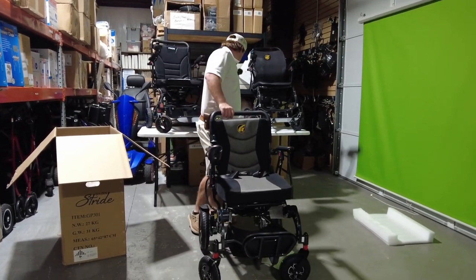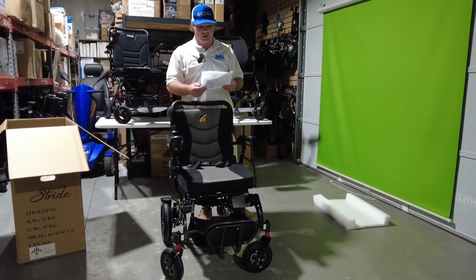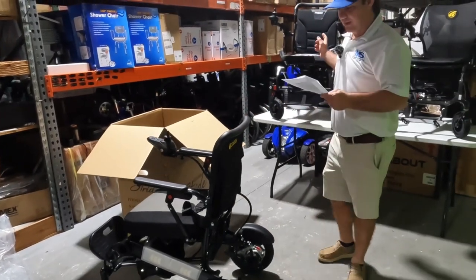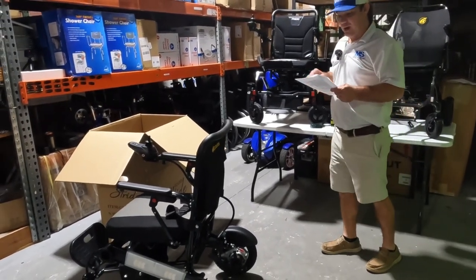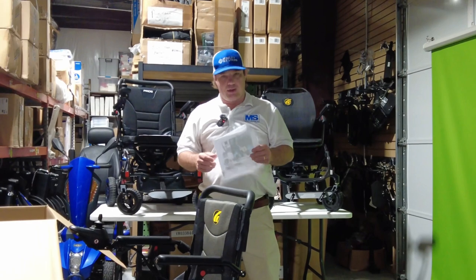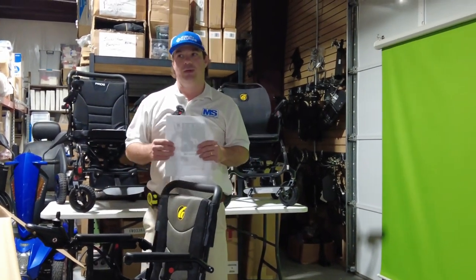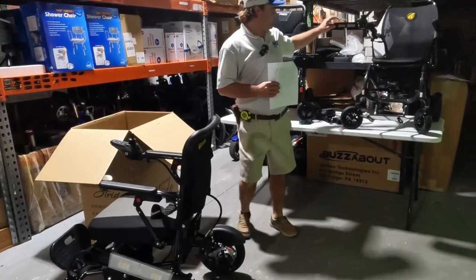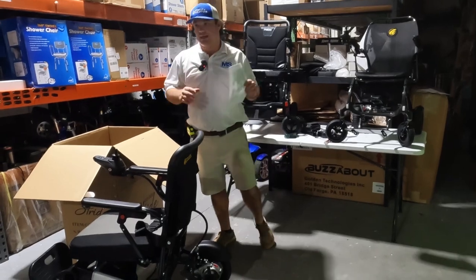So this is the Stride, model GP301 — we'll have some specs and a link to the spec page. It has a 265-pound weight capacity, where both of these I think have 300. Both of them get about 9.3 miles battery range, 3.7 miles per hour speed. When it comes down to it, it's programming. If you're buying this and don't like the setting, you can go to a local dealer and have them program it. We're going to do a comparison video and take it outside.